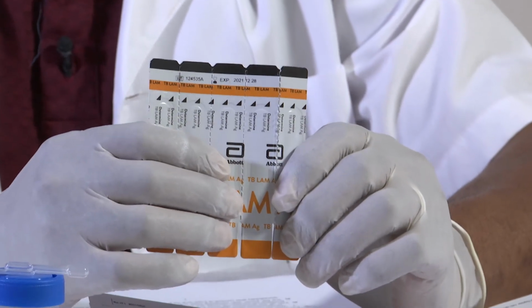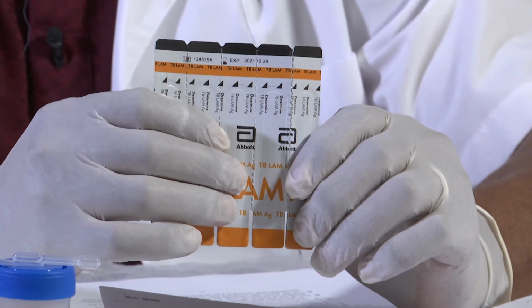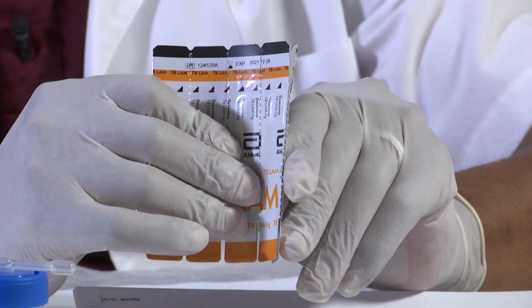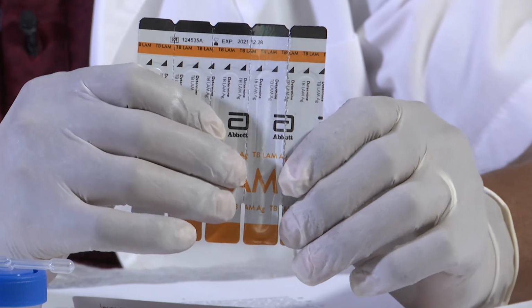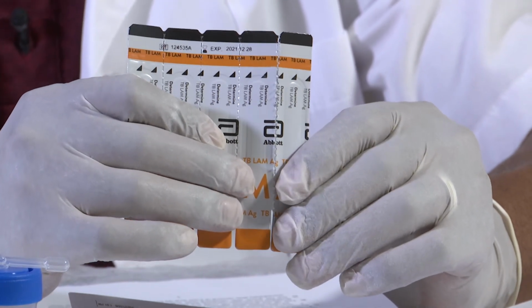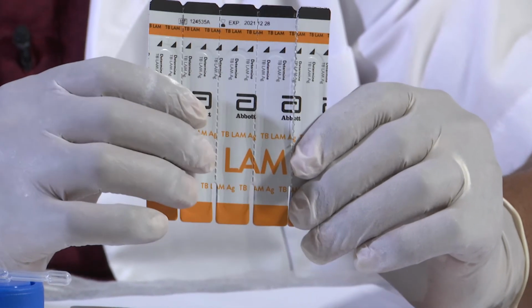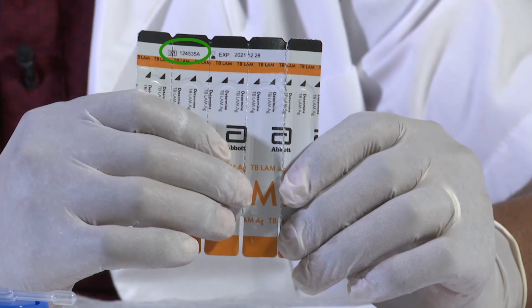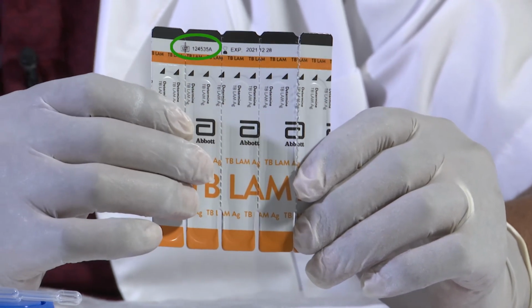So the next step is that you remove one strip from the 5 test card by bending and tearing at the perforation. Start the removal of the test units from the right side of the test card to preserve the kit lot number which appears on the left side of the test card.